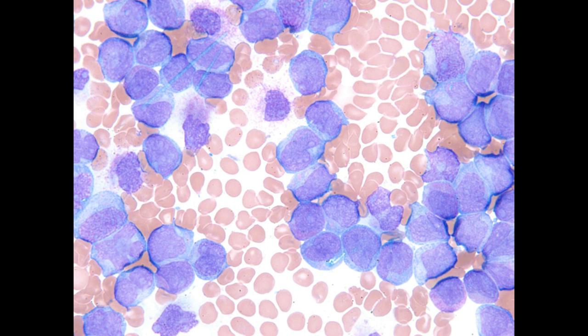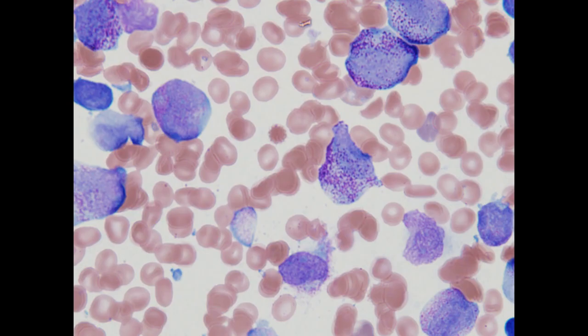If you look in the background, there are some cells that have sort of more heavy granules, and this is a difficult morphological call. Some of these cells look like monoblasts, but if I were to show you another patient with the same chromosomal translocation, you can recognize what this is. Here's the same chromosomal translocation presenting in a different manner. Here, these are easily recognized as hypergranular promyelocytes.